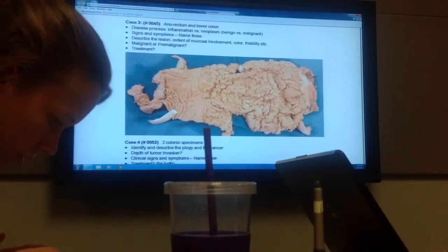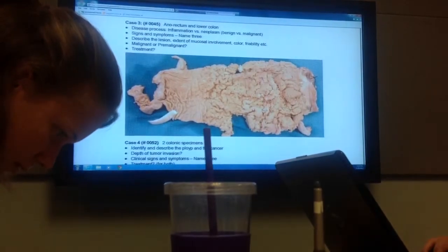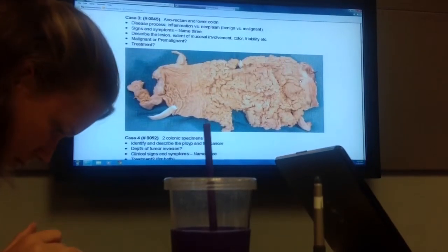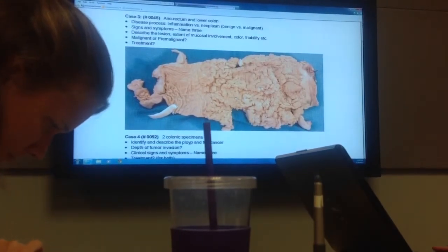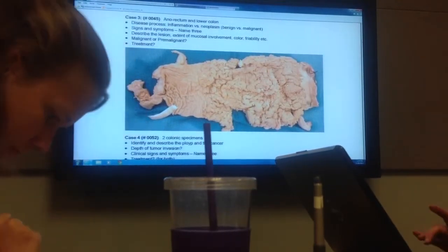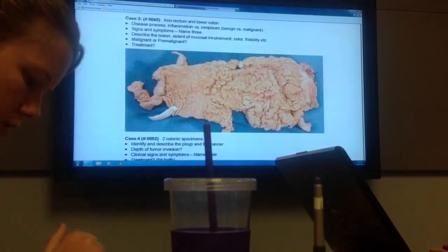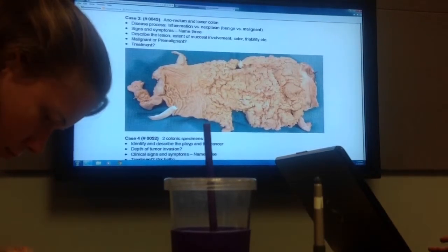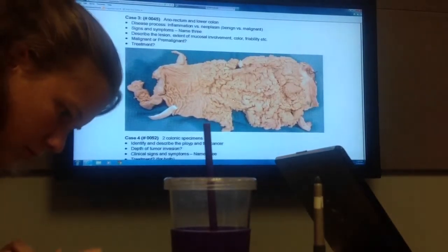Now, I can promise you this thing looks huge, and so there's probably some invasive cancer hiding in here somewhere. But we just never see these anymore because people get colonoscopy and get these biopsied and removed before they get this big. So if you had to look at the size of this thing, would you guess that this is pre-malignant, not malignant, malignant? It's probably at least pre, right? At least pre to malignant, I would guess. Okay, very good. And then what about symptoms?